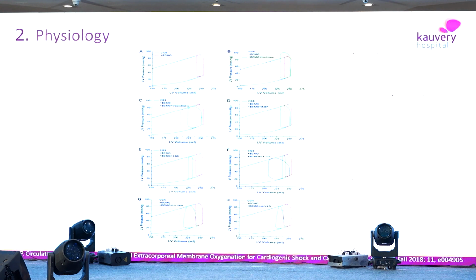Along with this, we always keep a watch, and these are some measures you institute whenever ECMO is instituted. For example, always consider vasodilators should your blood pressure allow you to do that, or at least make sure you are not using too high ECMO support. You use the ECMO support that is just enough to keep your perfusion pressure reasonable, that is 65 to 70. So that is what is shown in C. You use vasodilators or a lower setting of ECMO to get the MAP reserved, because your heart is acting against that particular afterload and SVR.